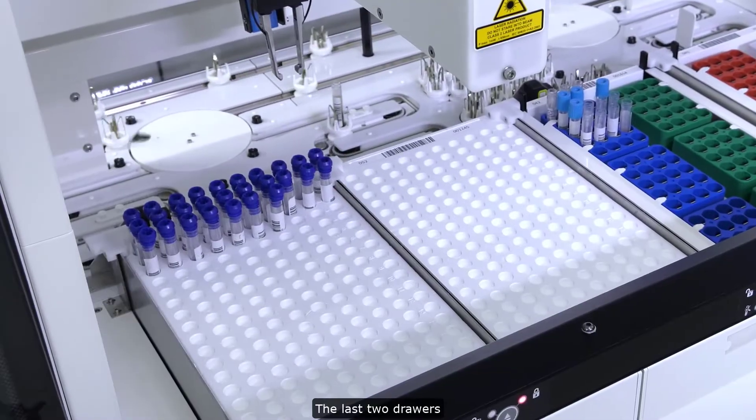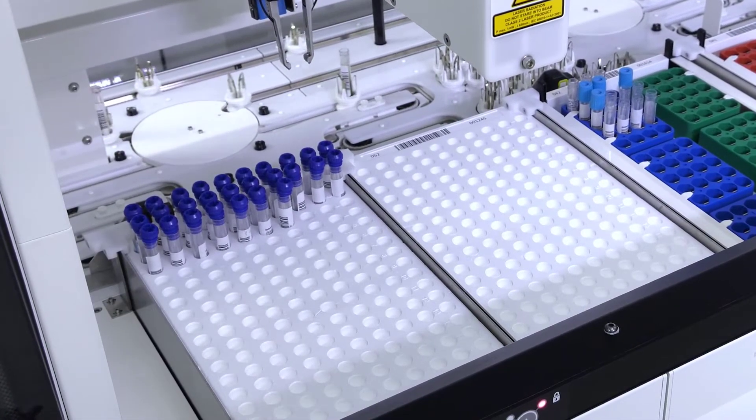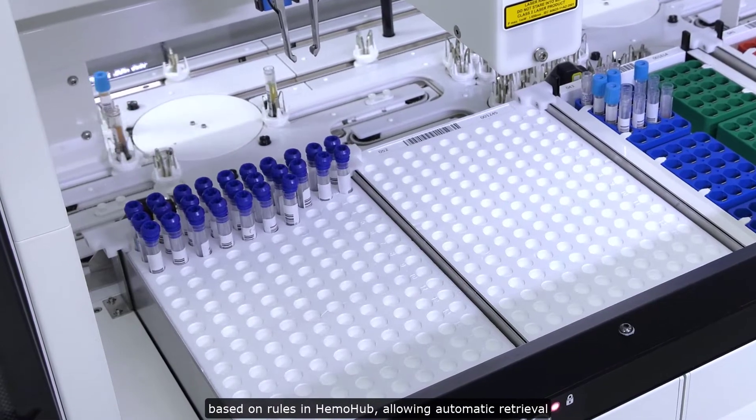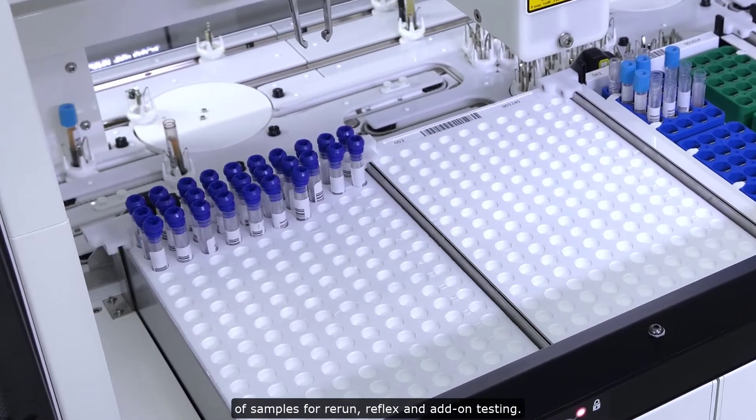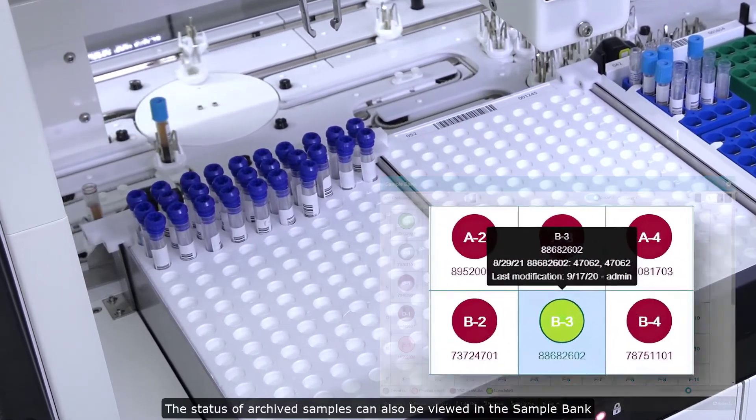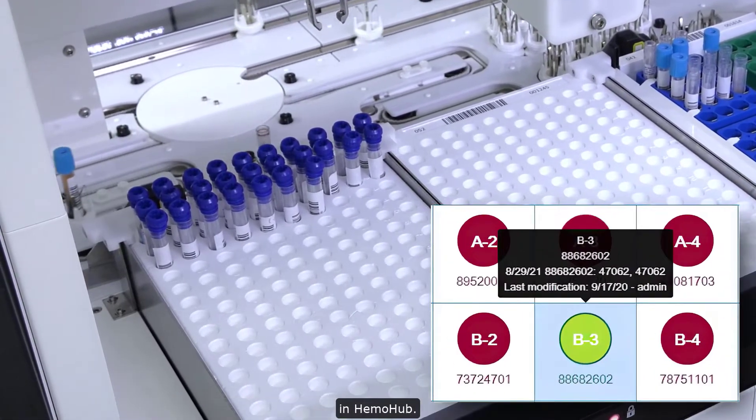The last two drawers are typically designated as archival areas, based on rules in HemoHub, allowing automatic retrieval of samples for rerun, reflex, and add-on testing. The status of archived samples can also be viewed in the sample bank in HemoHub.